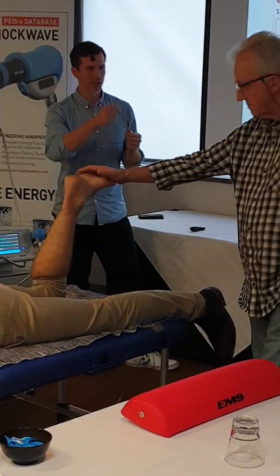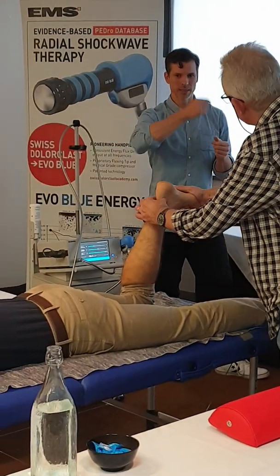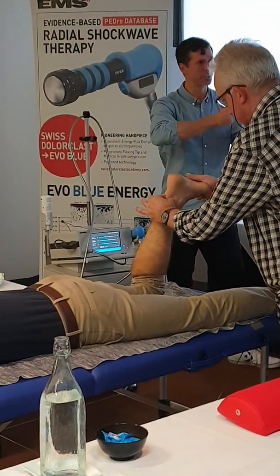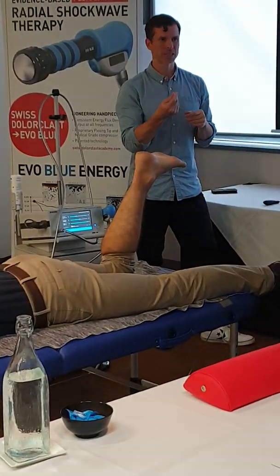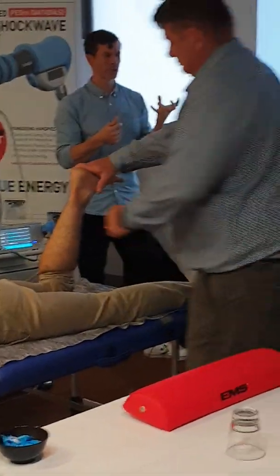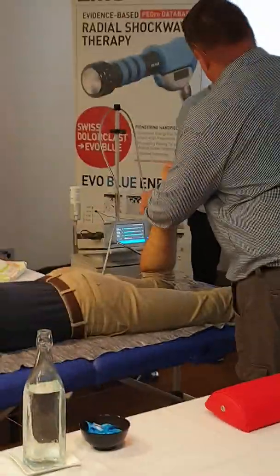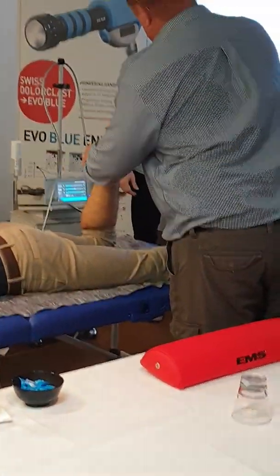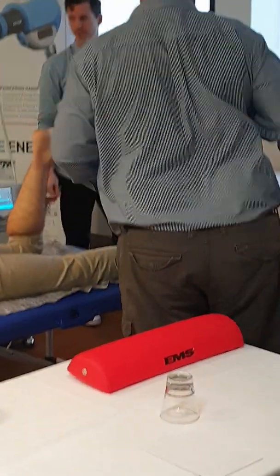And what you'll notice when you feel the tendon is that your fingers can glide much easier through there. Because remember, we're causing the secretion of lubricant, which lubricates those tendons. Yeah, that's one of the physiological effects. I know for me it took the thickness out big time.